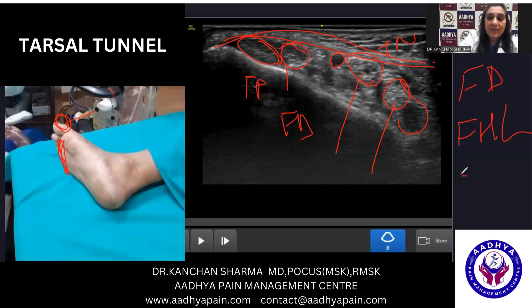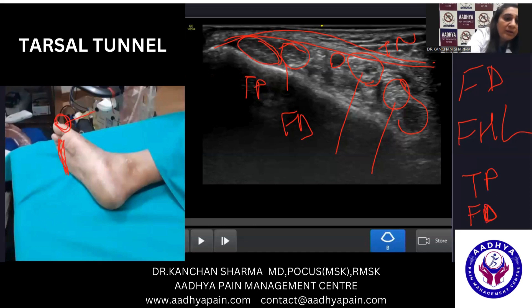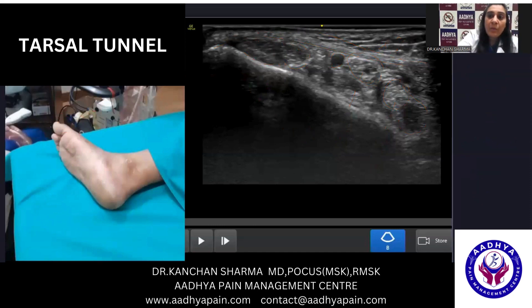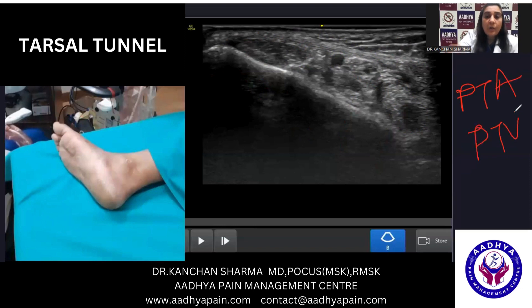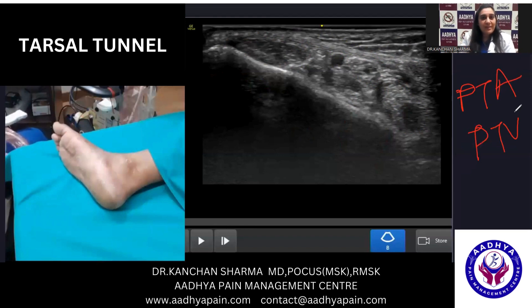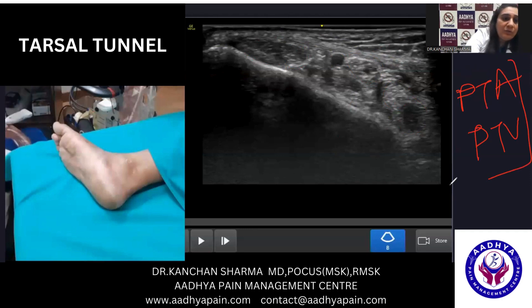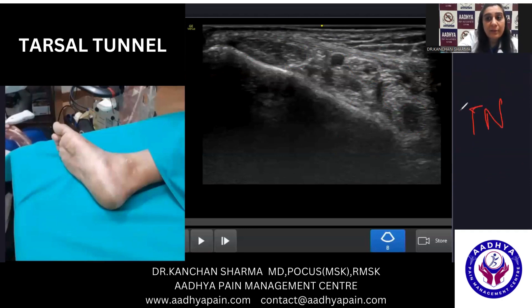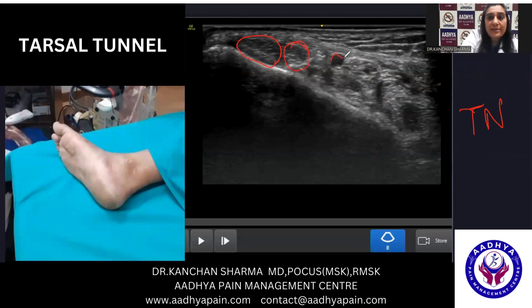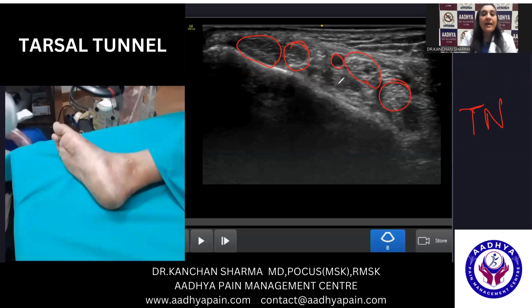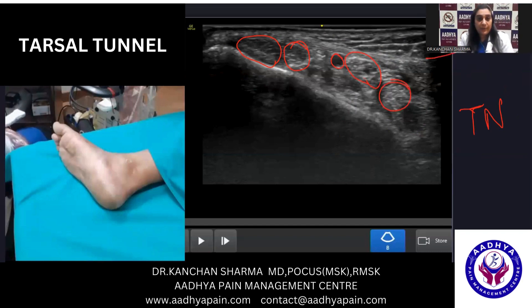If you look for the tendons, we have three tendons: tibialis posterior, flexor digitorum, and FHL. The two vessels we will be able to see are the posterior tibial artery and the posterior tibial vein — though the vein is not visible now because the compression I applied was sufficient to compress it, so we'll see them again with very light pressure. These are the two vessels in this compartment, and then you will see one nerve — the tibial nerve. So to revise: this is tibialis posterior, that is your flexor digitorum, that is your artery, this is your nerve, this is your FHL, and that is your flexor retinaculum.